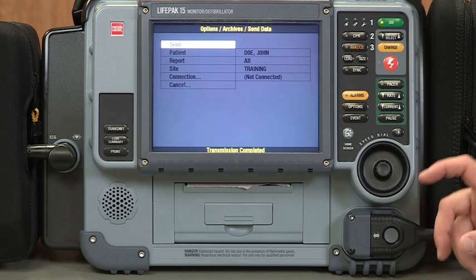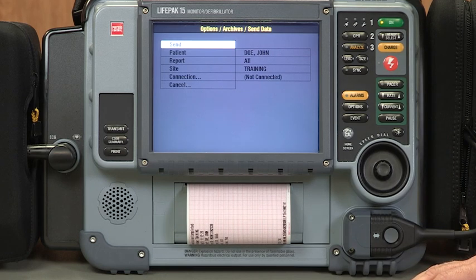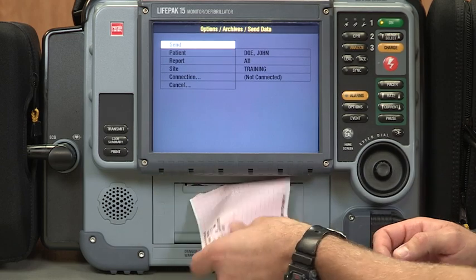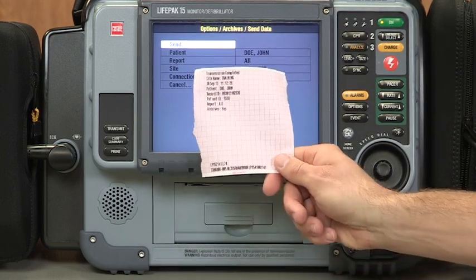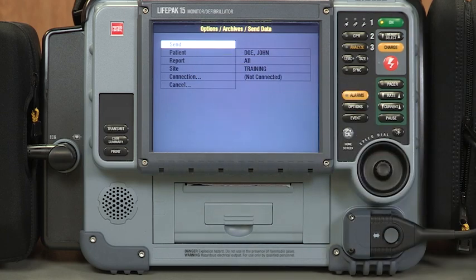I'm not sure if you can hear those beeps, those tones that the LIFEPAK just made, but you will be able to hear them once you stand next to the machine and you actually transmit an event yourself. You'll also notice that there's a printout here now that lets us know that our transmission was complete. You'll need to make a copy of this, attach it with your MRF form and your SunPro report, and email that to myself and Captain Johnson in the training division.